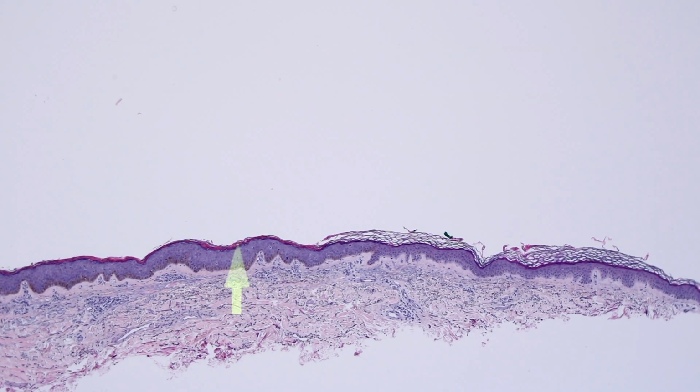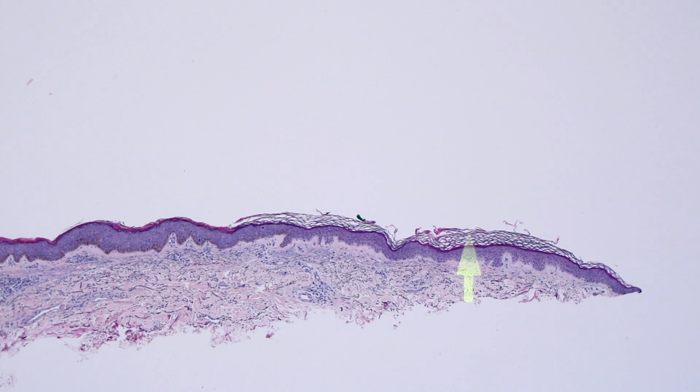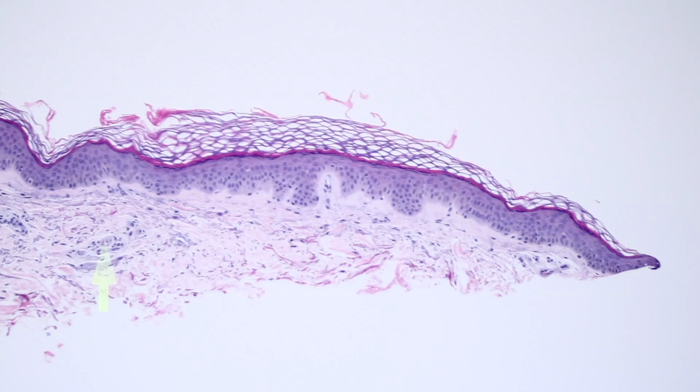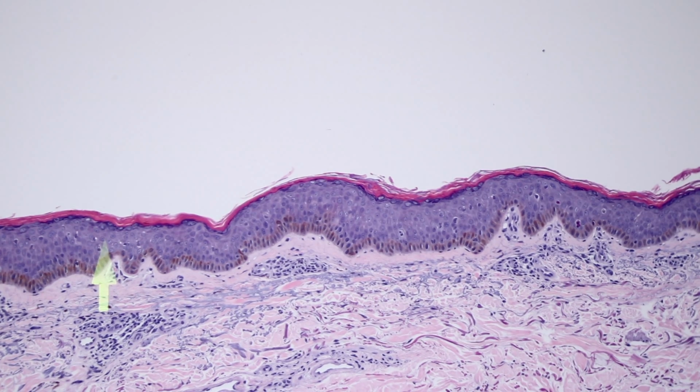And look, now it's very thin and compact, either ortho or parakeratin over here. And also look, the epidermis here is not as thick. It gets thicker over here, and it's much more blue over here. Again, I wish I could get this light just right to make it work. Maybe that helps a little bit more. Let's go closer to see. That's normal. And that's squamous in situ.